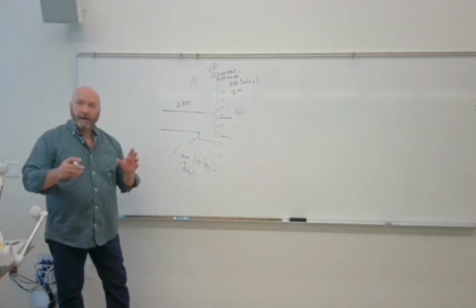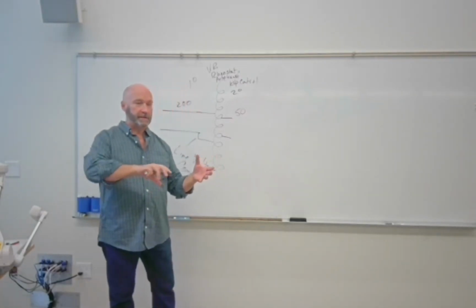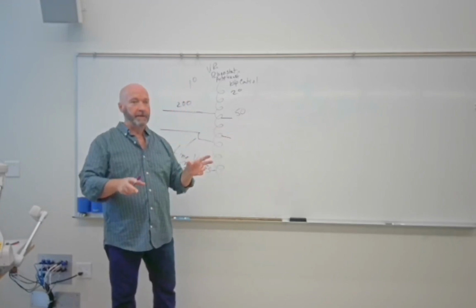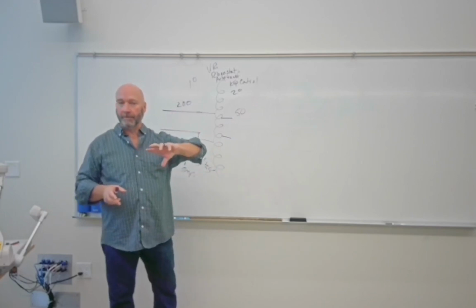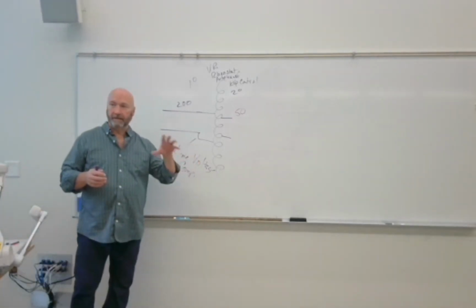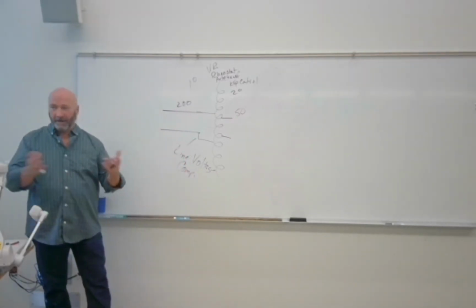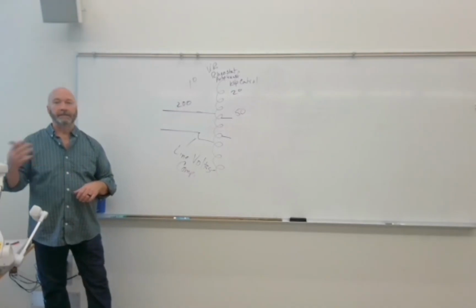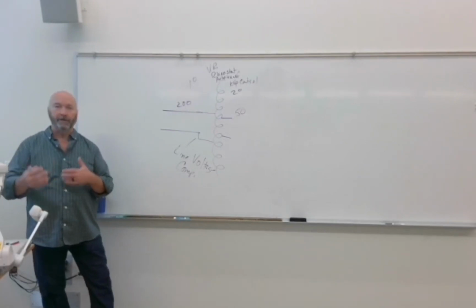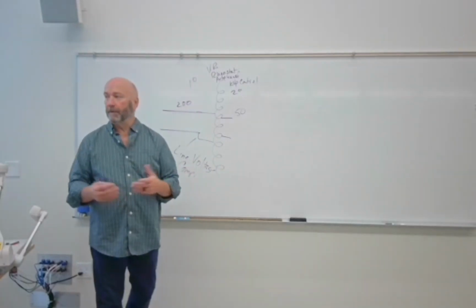And with a single phase machine, you'll have 2 different dials. So you can identify a single phase machine: instead of having buttons to adjust kVp, mA, and time, it's going to have knobs. Those knobs go clack, clack, clack every time you move them. On a single phase control panel, you will see major and minor kVp adjustment. You're not going to see that in a hospital. Those are obsolete except possibly in a doctor's office, vet clinic, something like that, where output doesn't need to be quite as high, and they're working off a budget basically.